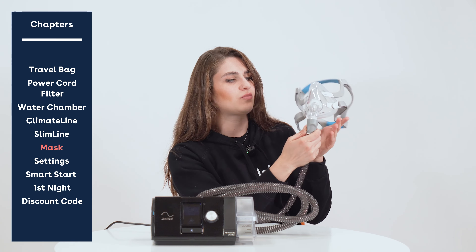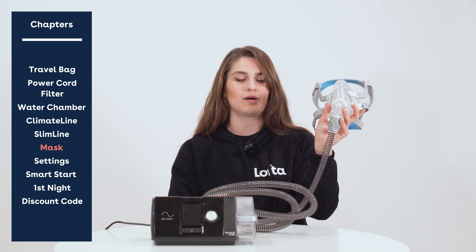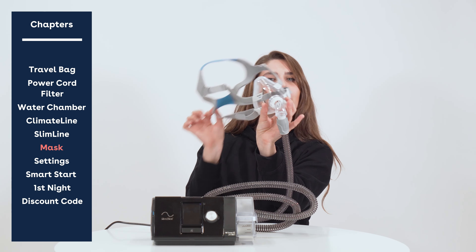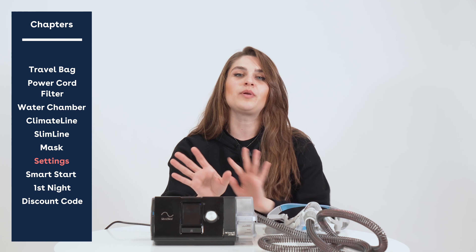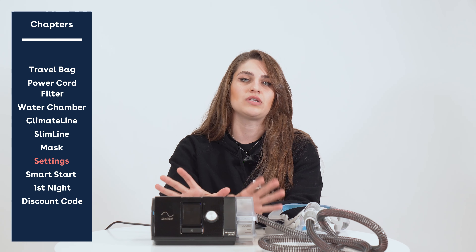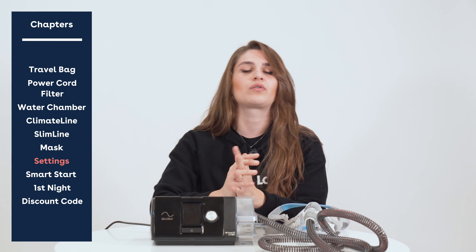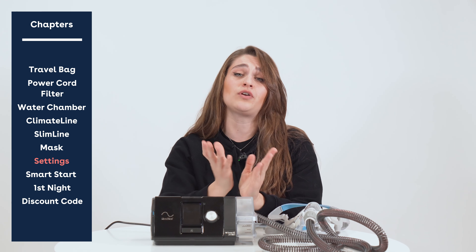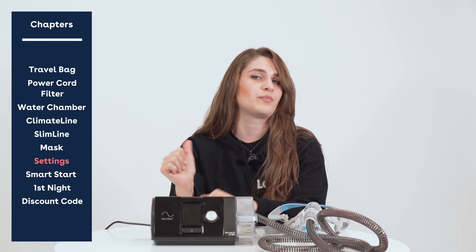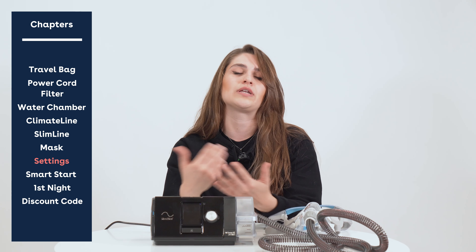For this demonstration we're using the ResMed AirFit F20 full face mask, which is our top selling full face mask on the entire website. Before we move on, there are no other settings you need to worry about — our team has already pre-calibrated your settings according to your prescription. If you're a LoftiCare member, a respiratory therapist can go ahead and make adjustments for clinical or comfort indications.